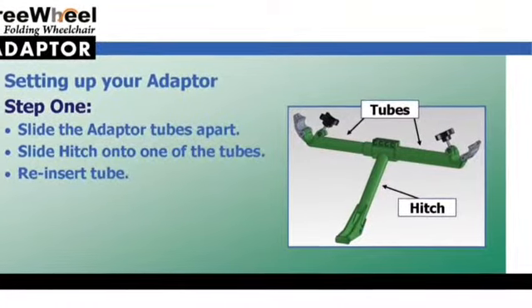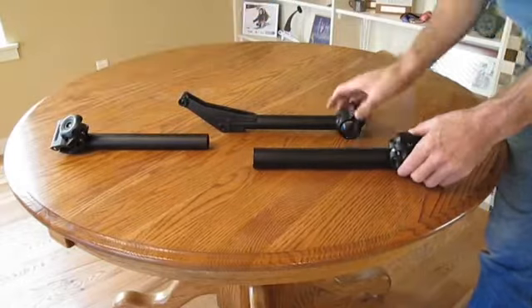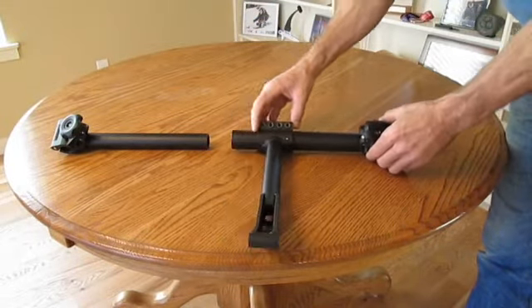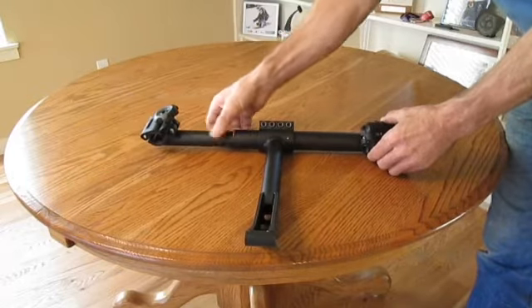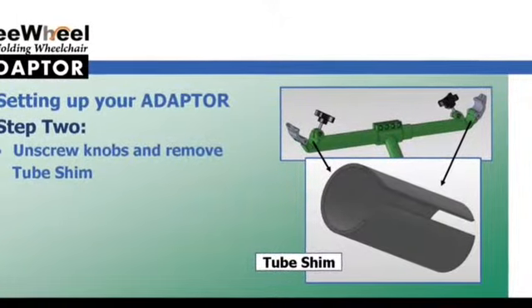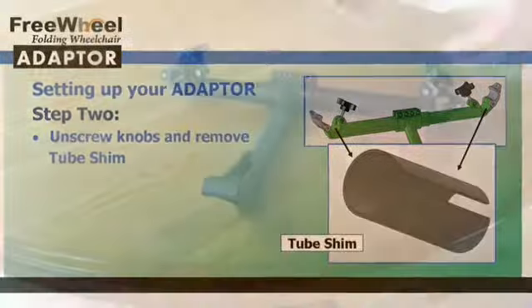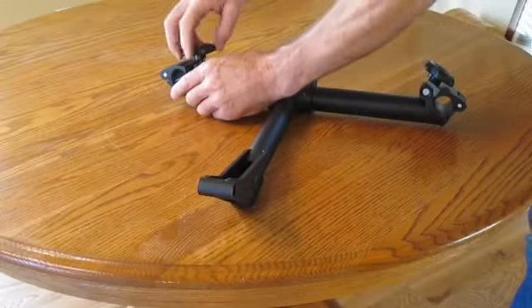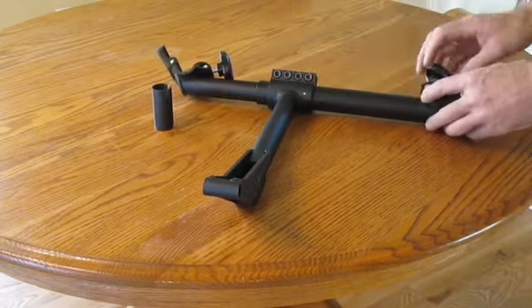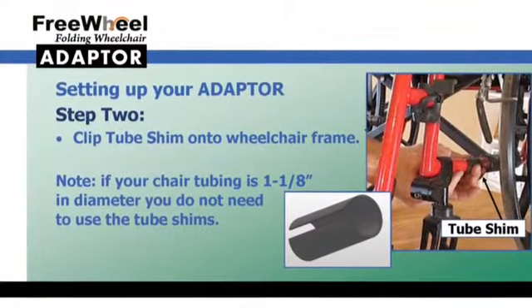You will now be putting the adapter together and setting it up for your wheelchair. This section of the video shows how you separate the two tubes and slide the hitch onto the tubing. In step two, unscrew the large knobs on the tubing and remove the tube shim on each end. These should be clipped onto your wheelchair frame.